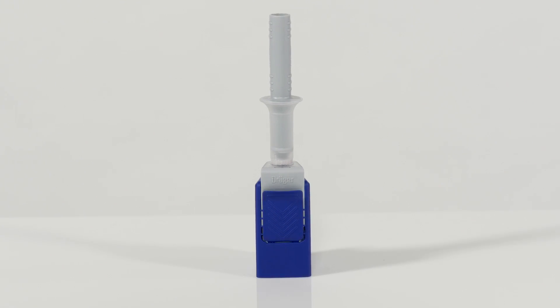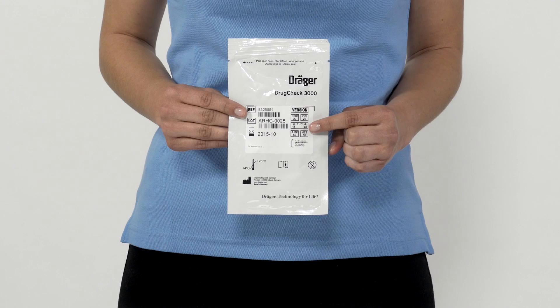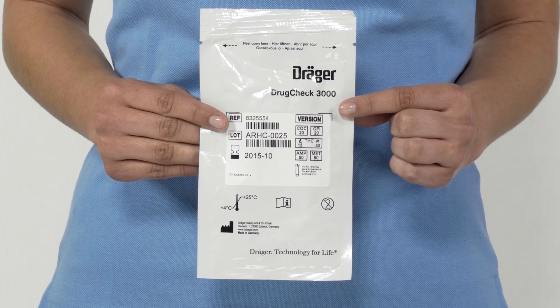The respective waiting or pre-incubation time must be strictly adhered to. Full information on wait times for THC testing, as well as limit values in nanograms per milliliter for all substances, can be found on the Draeger DrugCheck 3000 packaging.